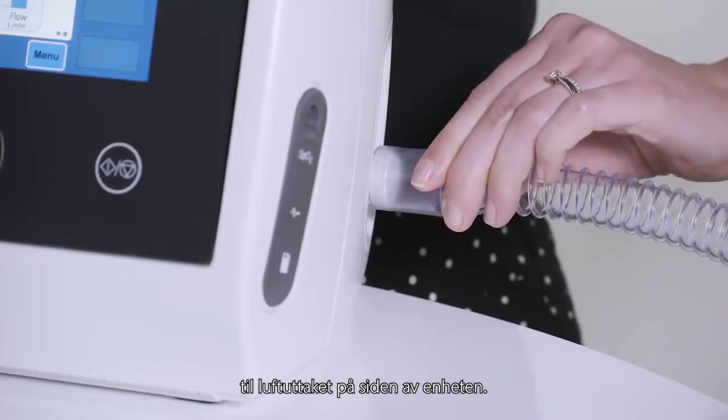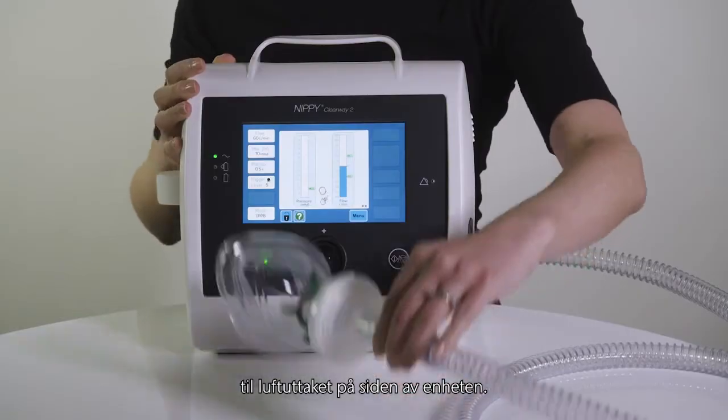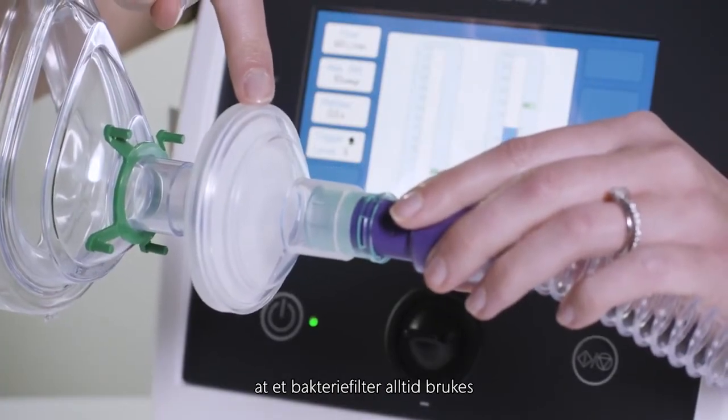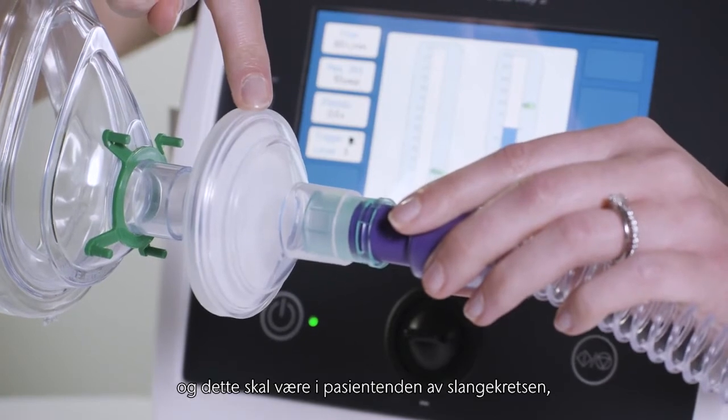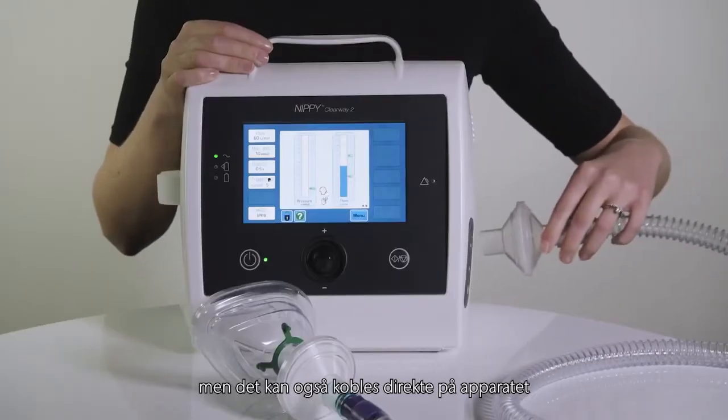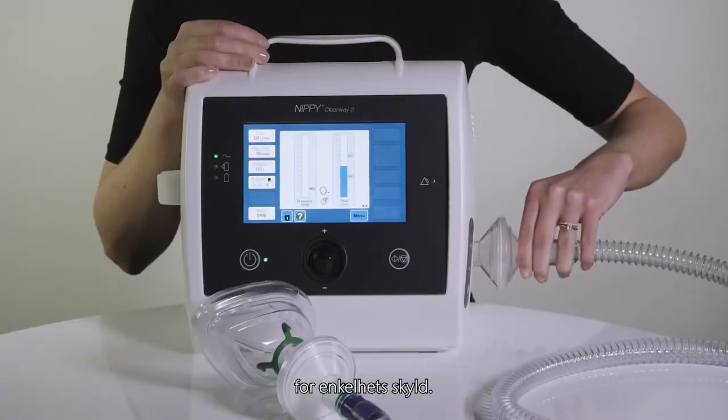Connect the Clearway 2 circuit to the air outlet on the side of the device. Breas recommend that a bacterial filter is always used with the Clearway 2 and this should be at the patient end of the breathing circuit, but it can also be connected directly to the Clearway 2 for convenience.